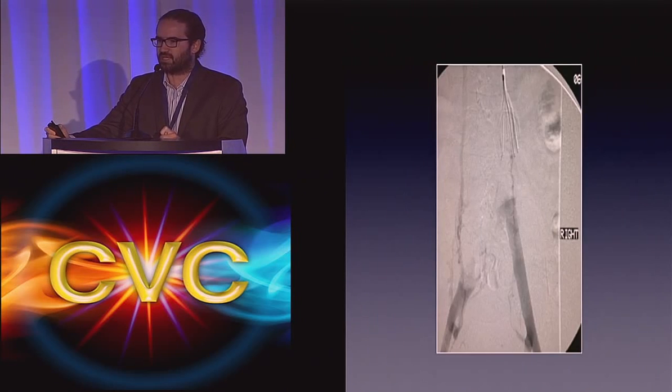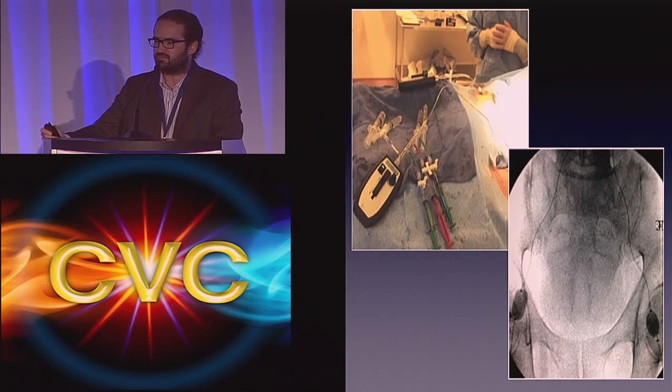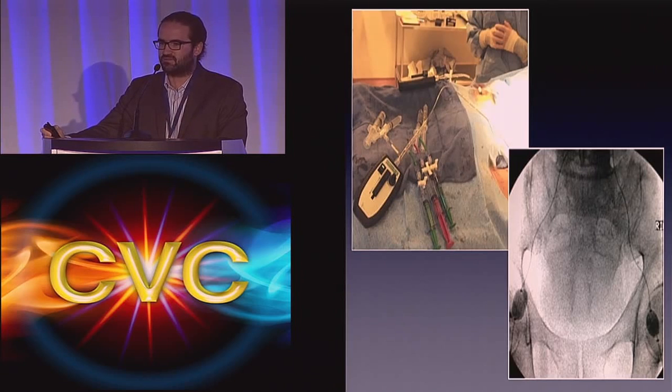This is one of the cases where you would see the occlusion related to the IVC and the filter. As you advance the device, as I showed before in the little chart, you put them both in a kissing fashion all the way up, then you activate that. Then I would say every operator I've seen does this in a different way. We'll usually put 1 to 5 milligrams initially, and then every minute that we change the oscillation patterns, we'll give an additional milligram of TPA and so on and so forth to reach a total of 10 milligrams.